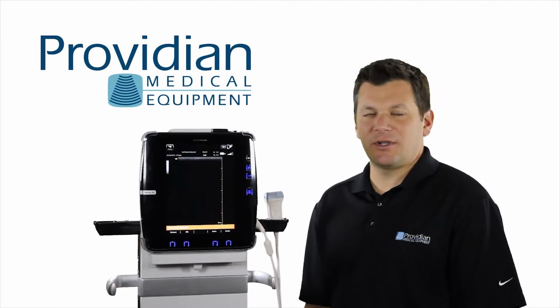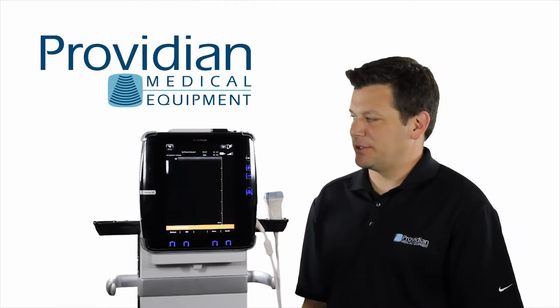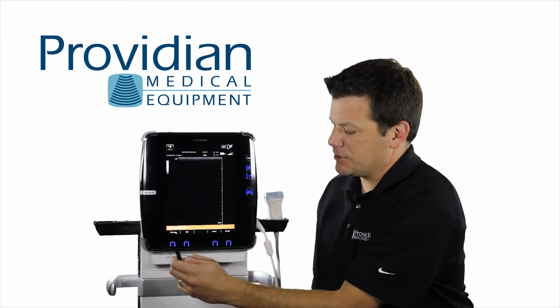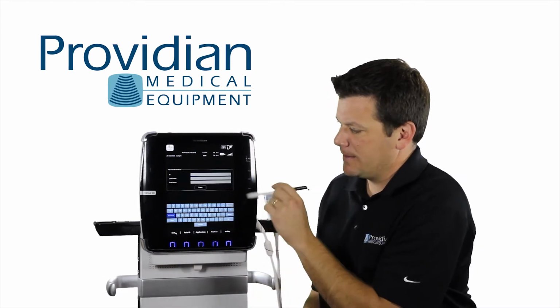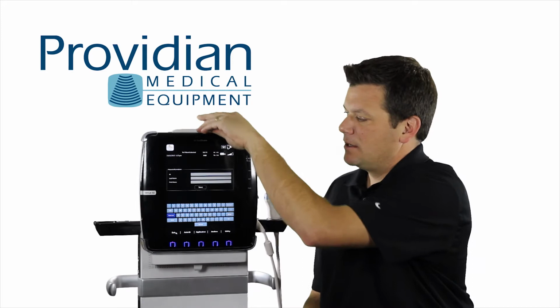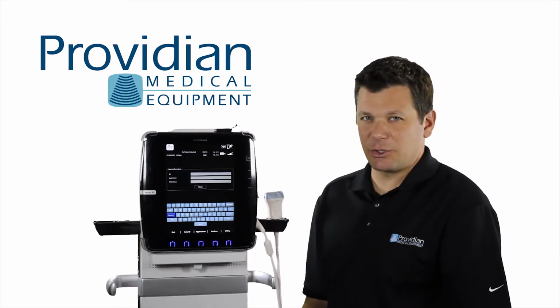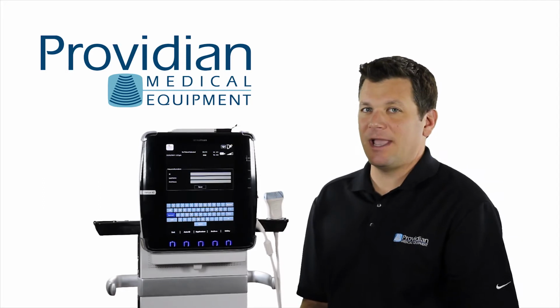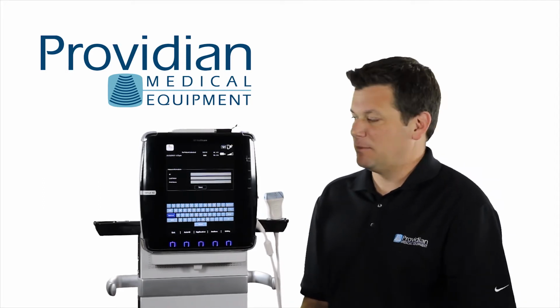So let's go on to starting an exam and selecting your application. I'm going to go over here and I can click on the patient in any number of ways and it's going to set this up. Now it's a little tricky because it's always going to show up as blank, thinking that you're going to enter a new patient ID. If you already have a patient selected, you can skip this and move on.